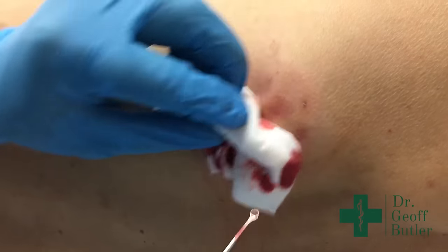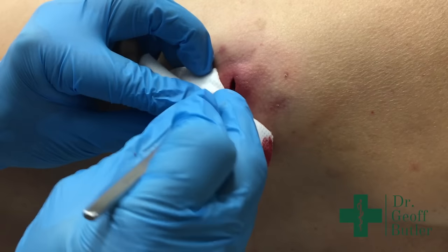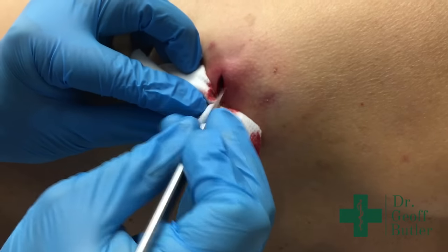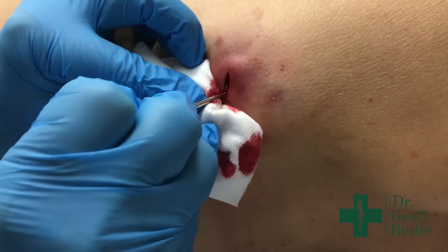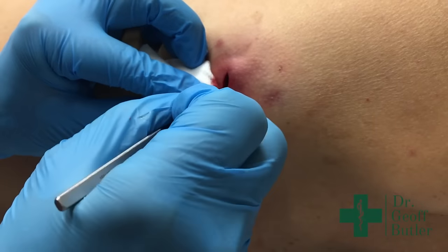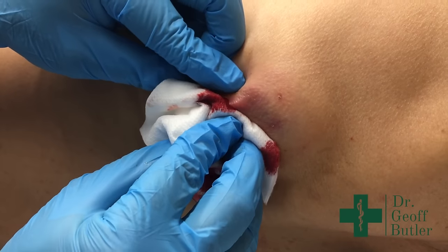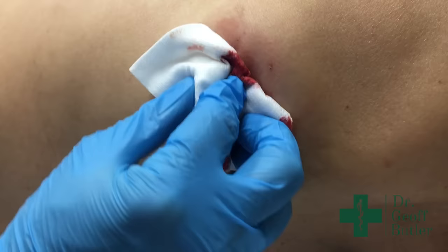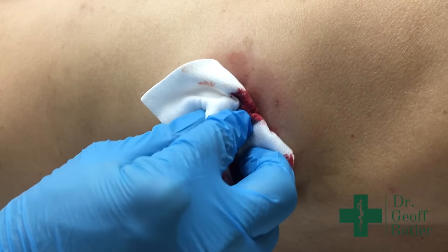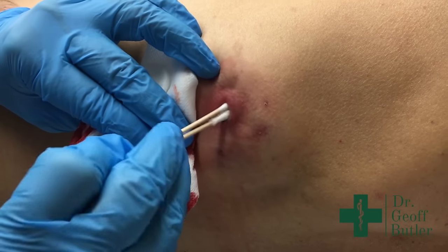How long was the cut? Maybe about a centimeter. Over an inch? No, less than that. So because the anesthesia is good in this case, I'm being a bit more aggressive with the curette. You're okay there, Tom? Oh, I was okay. Good. Now I'm going to use just some absorbent Q-tips and see if we can clean that out a little bit.